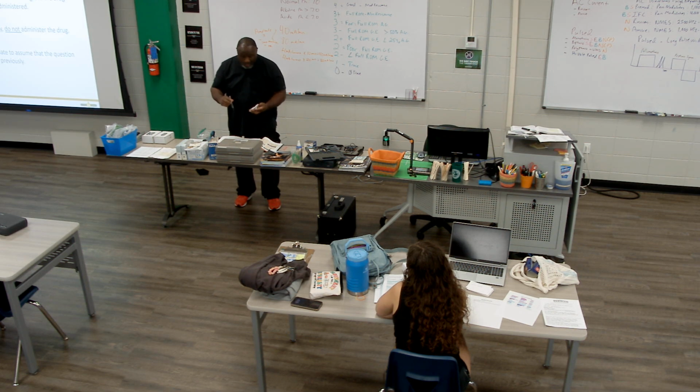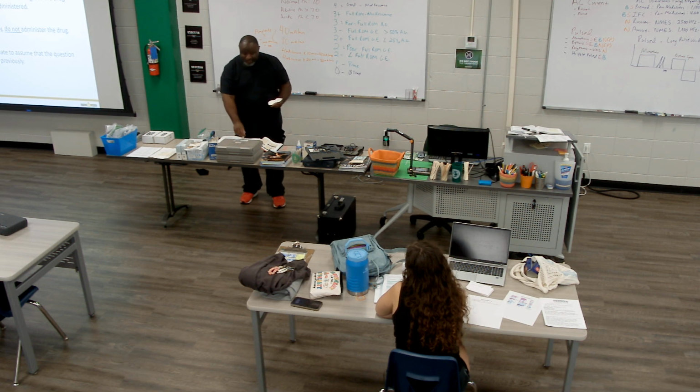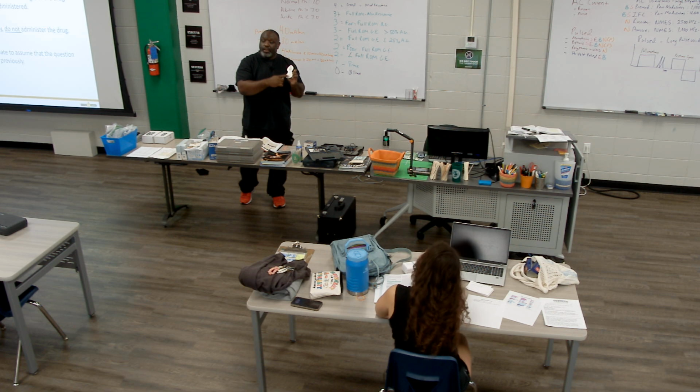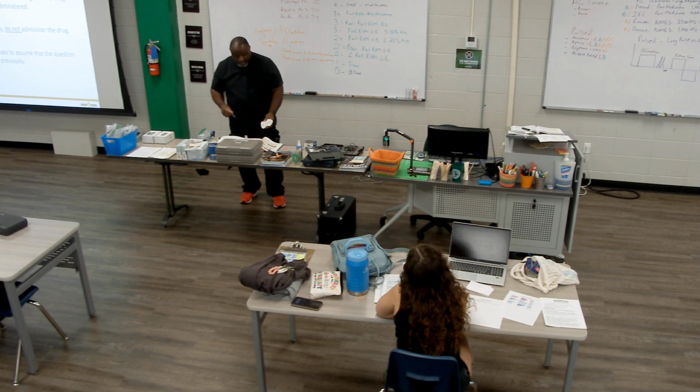And then all I want to do is hold it over the electrode that corresponds with the polarity of the drug. So let's say this is dexamethasone phosphate. I'm going to hold this over the negative portion of my electrode, and I'm just going to soak the electrode. You're literally just pouring it out and soaking it. Make sure you get the whole thing, soak it as much as you can.